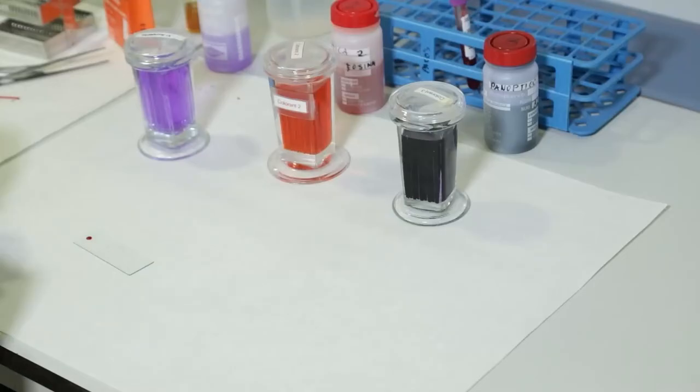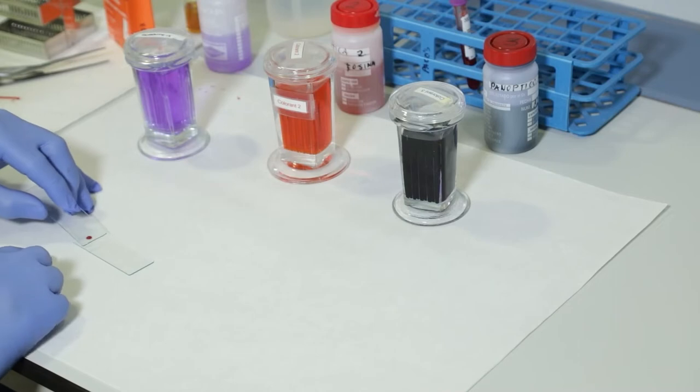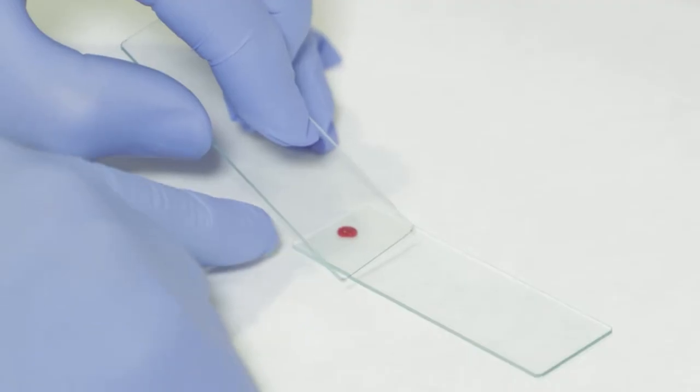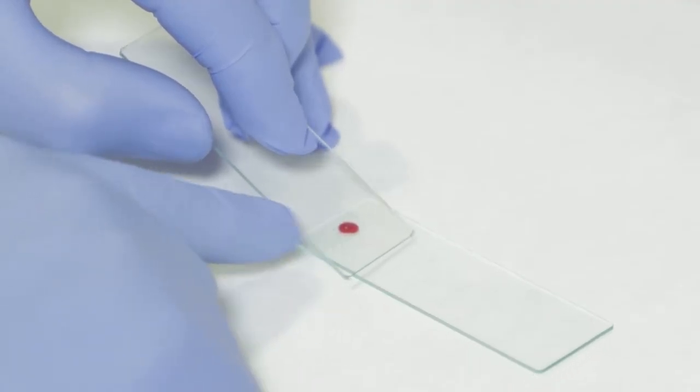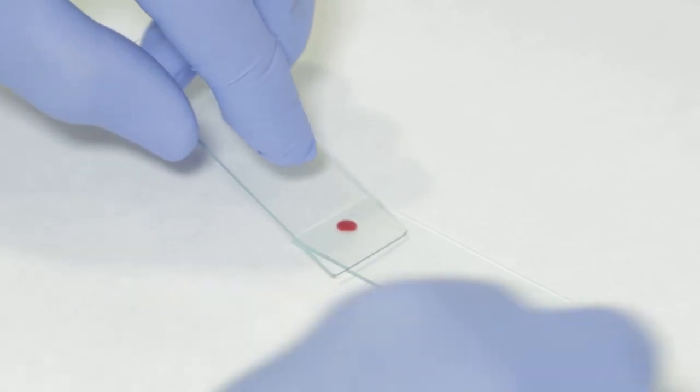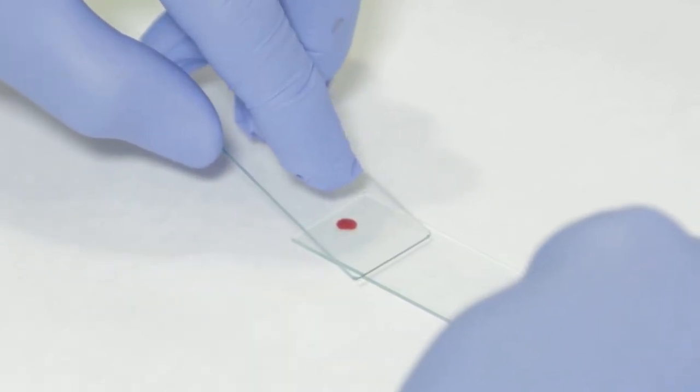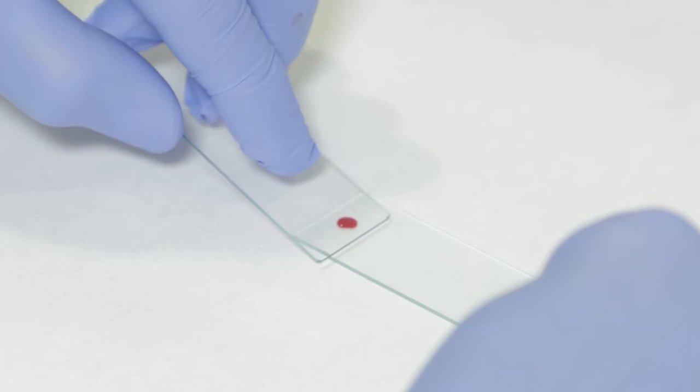With the use of another glass slide, which is polished along its edge, it is placed more towards the center of the slide while forming a 30 degree angle regarding the first slide with the drop of blood. By capillarity, the blood drop will extend along the surface of contact between the slides.